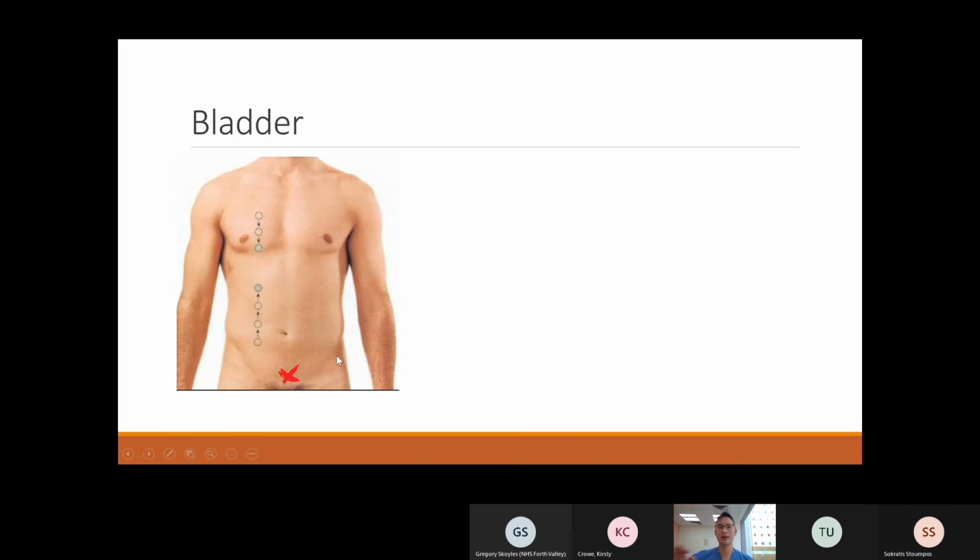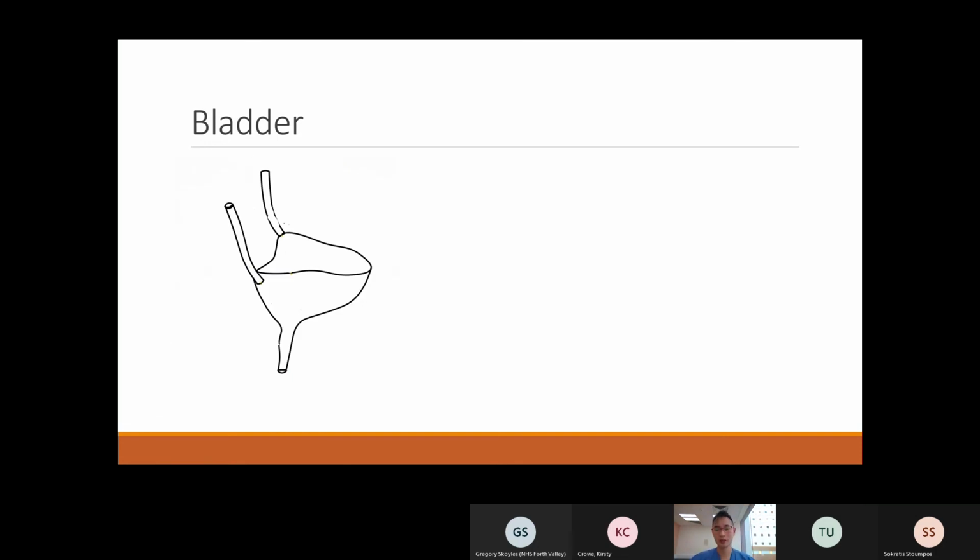What I normally do is I look for the pubic bone, and I go above the pubic bone. I put the probe on it, in that area, and I almost press downwards. I press down into the mattress and angle it and rock it such that I look at the patient's foot. So I peek behind the pubic bone to look for the bladder. That's where the bladder sits. Okay, the bladder looks like this, almost a triangular or rather a pyramid-looking structure.